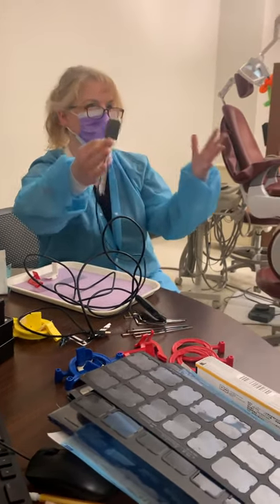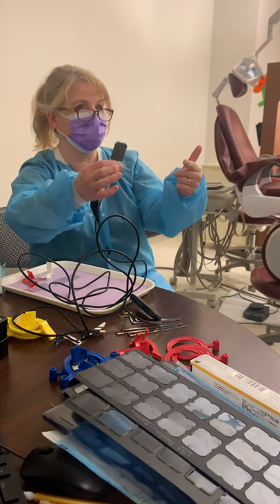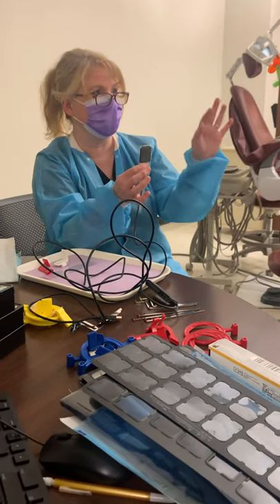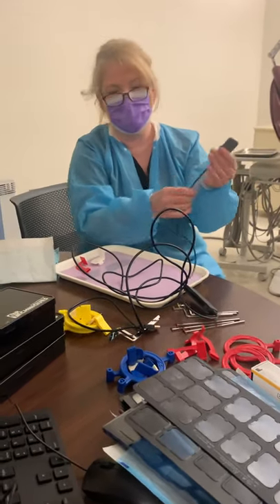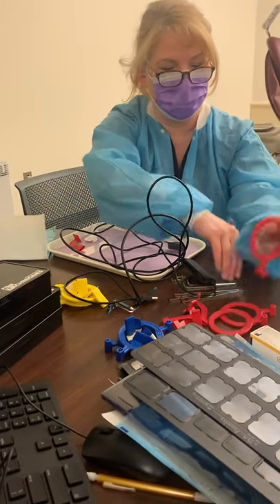We don't have to set up a full mouth series right now, but what you will have to do is pull up a full mouth series mount in your computer. You'll take them sequentially and you'll see them pop up as you're taking them. Our XCPs are a little different — your ring and your bar are the same.